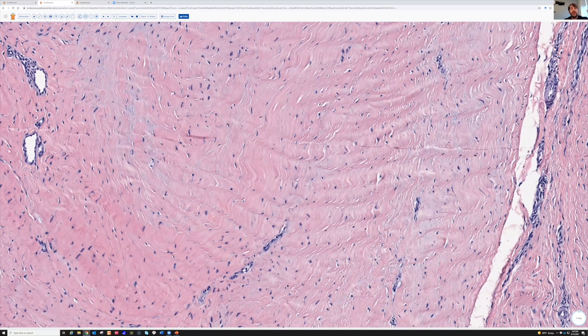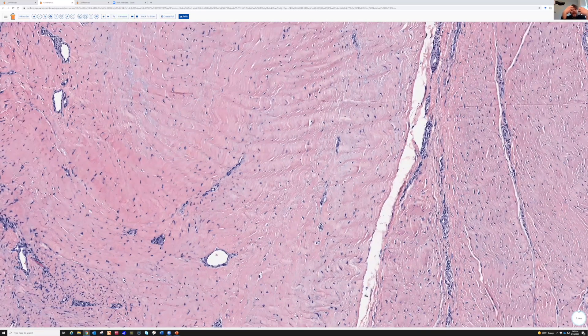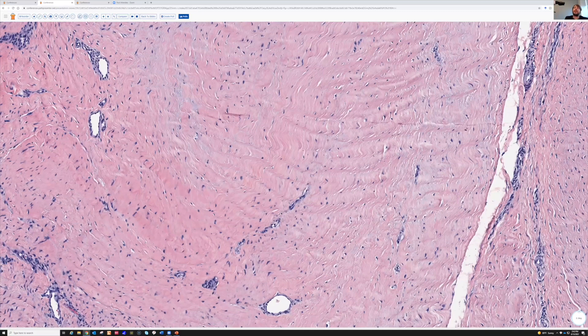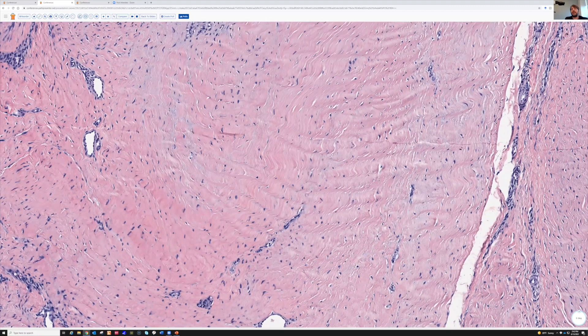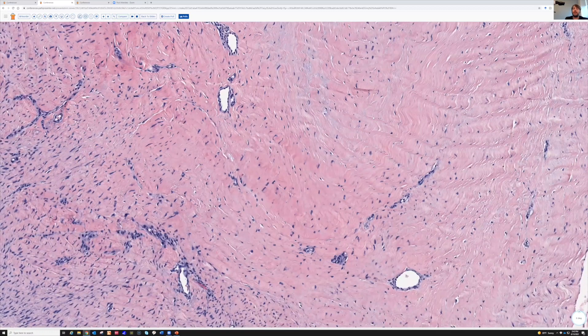This is the ramen noodle sign, which tells you something is dense, regular connective tissue — tendon, tendon sheath, fascia, ligament, any of those. Or in the setting of a neoplasm with this kind of pattern, you could think of neural, but what I think of first is fibroblastic differentiation, because fibroblastic lesions tend to have similarities to this and they kind of shrink up and it looks like ramen noodles — or like an accordion. I like the ramen noodle sign in honor of my former fellow, Dr. Ed Fulton, who came up with that.